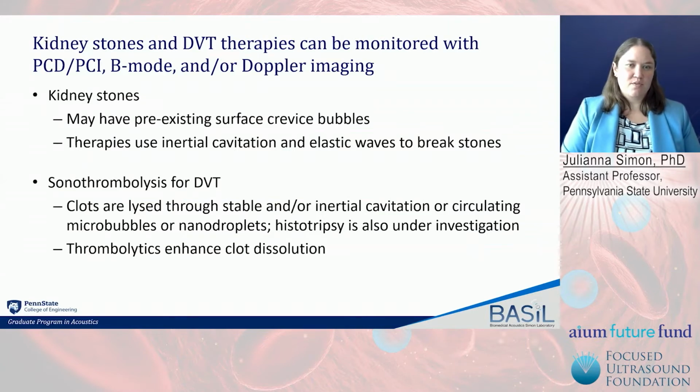Sonothrombolysis for DVT shows that clots can be lysed through stable and/or inertial cavitation using circulating microbubbles or nanodroplets. Histotripsy is also under investigation to create those bubbles and break up the clot. And thrombolytics are very important to help enhance that clot dissolution as the sonothrombolysis works.